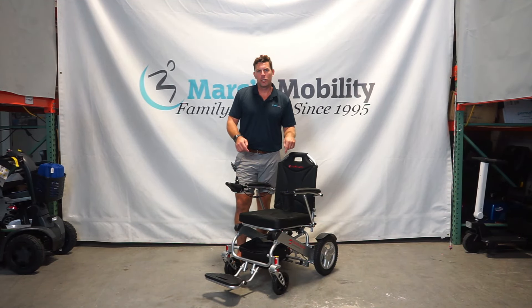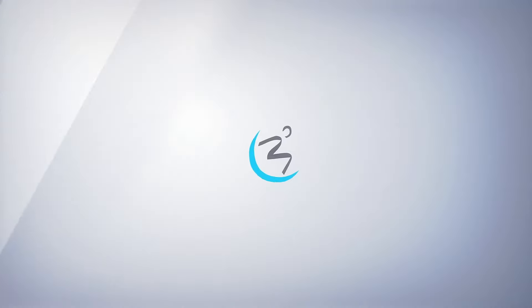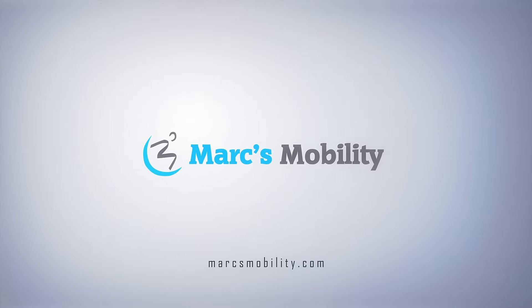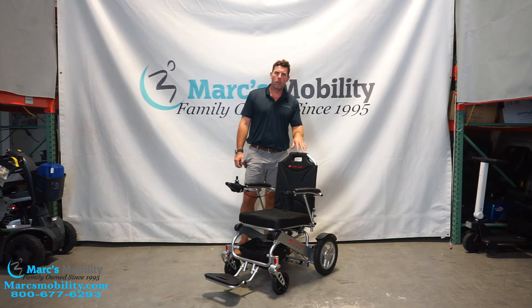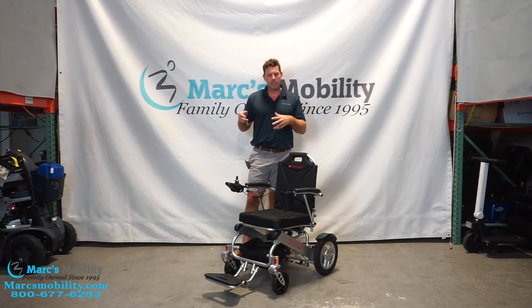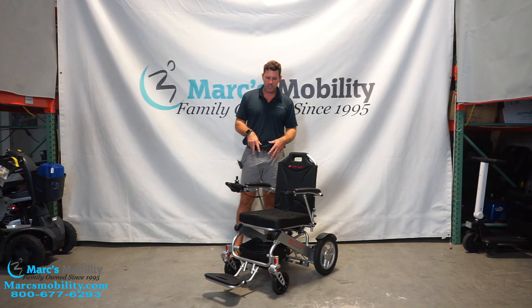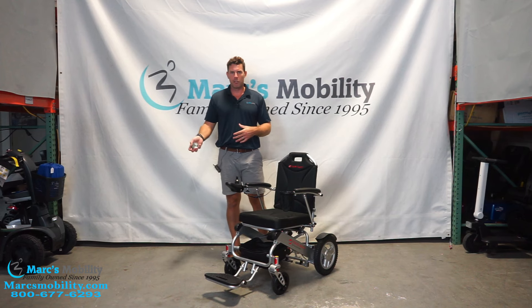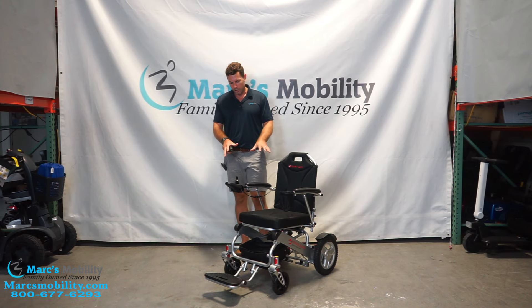I'm Alex with Marks Mobility, and what I'm going to show you here is the best bariatric folding power chair on the market currently today. What we have here is the City 2 Plus. I have done videos before on this unit, but they've made a few changes and enhancements over the years. This is the most current, up-to-date one — we just got these in on the last shipment and I talked to the general manager at Travel Buggy to go over what the changes were, so I want to relay that to everybody.